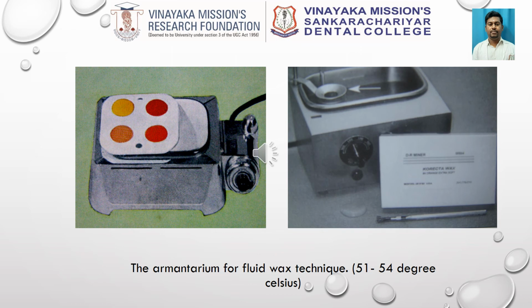After the custom tray is readied, a water bath is heated to an approximate temperature between 51 to 54 degrees Celsius, wherein the compartment of the fluid wax is kept and allowed to melt.